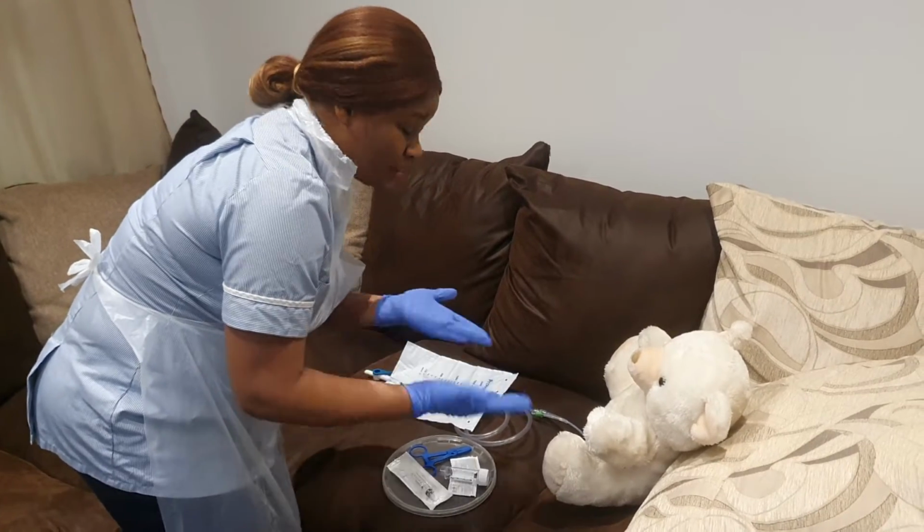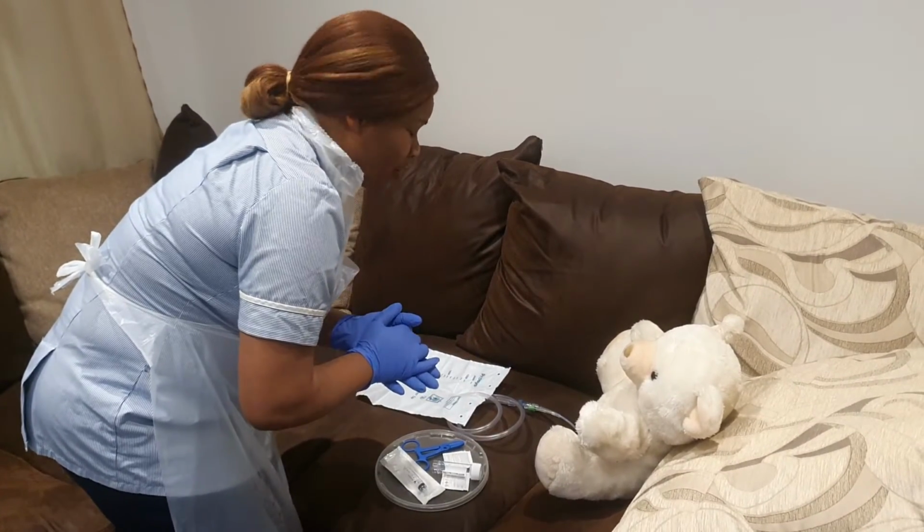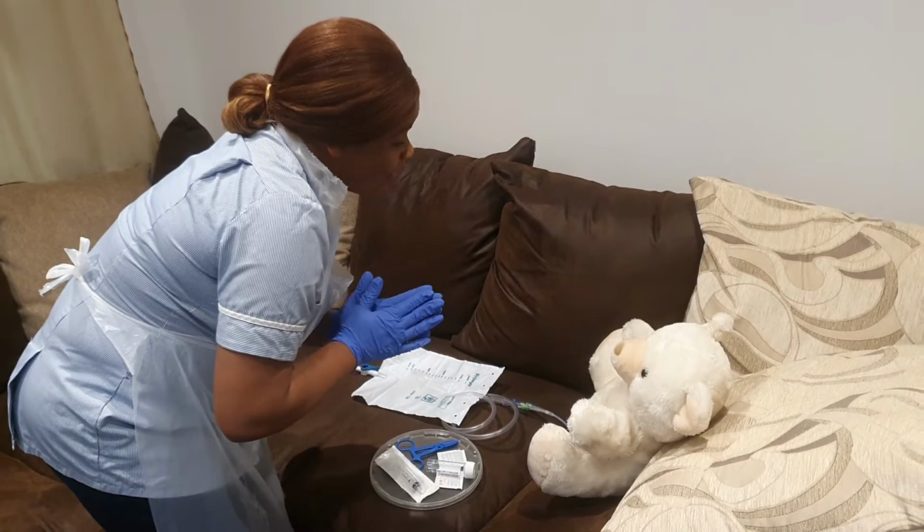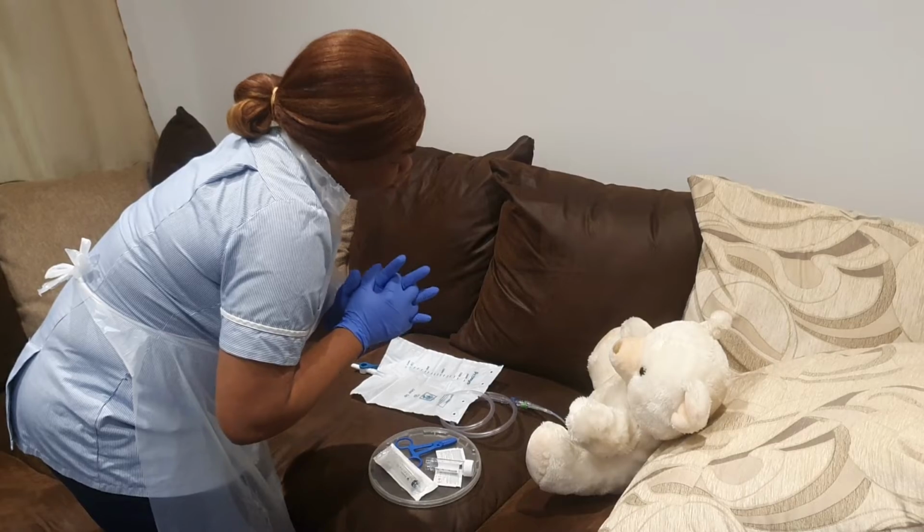Are you happy for me to expose you? Yes. Lovely. Thank you so much for your cooperation. So I'll just be clamping your catheter. When I clamp your catheter, you may feel some slight pain, all right?